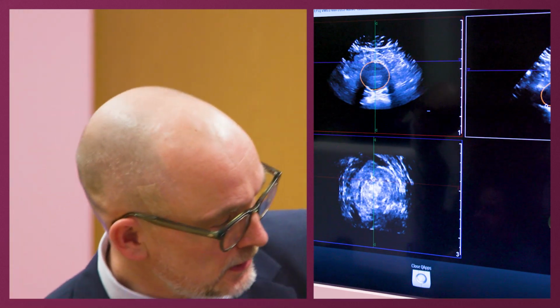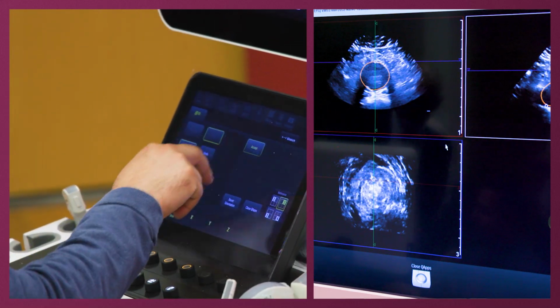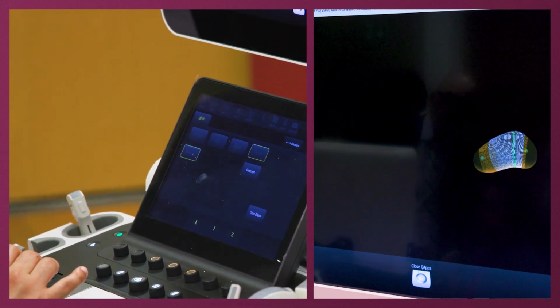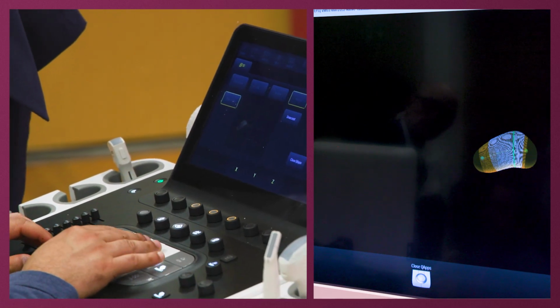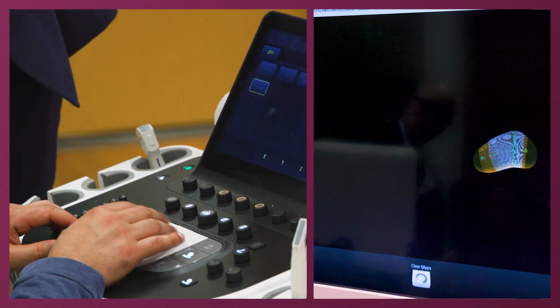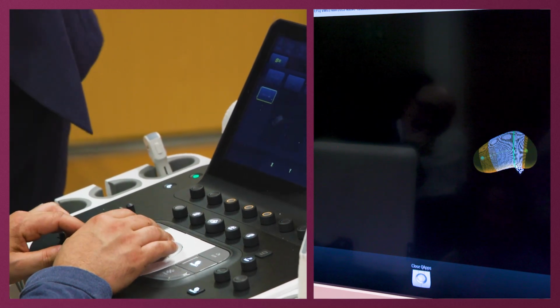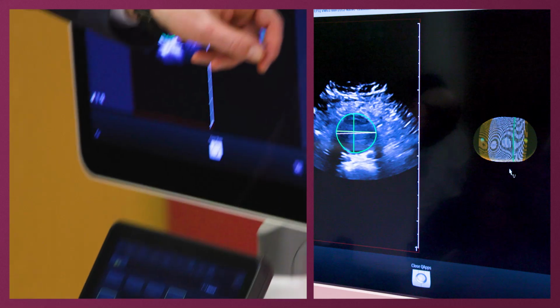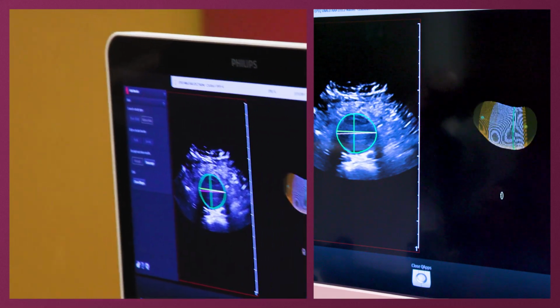Okay. So now you push. Let's see. I accept, I guess. Yes. Okay. So now it gives you the largest AP diameter and the lateral diameter and the largest diameter in any direction. It actually also gives you a partial volume here. Yeah. Nice.